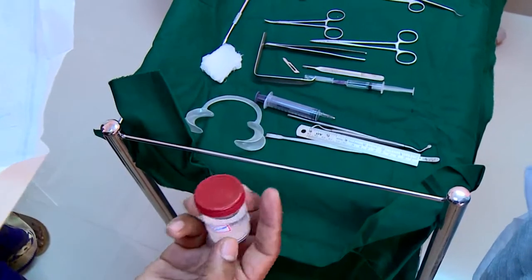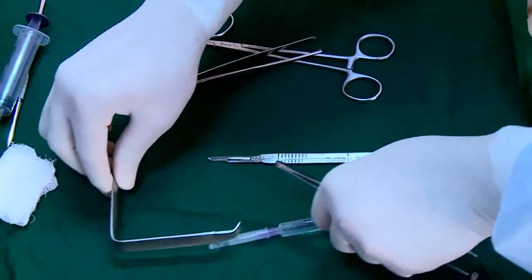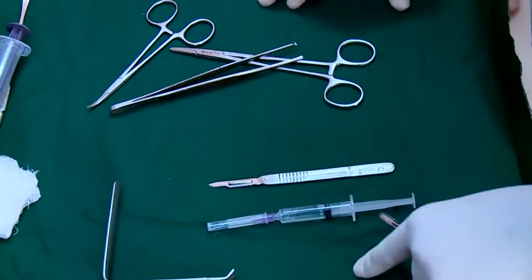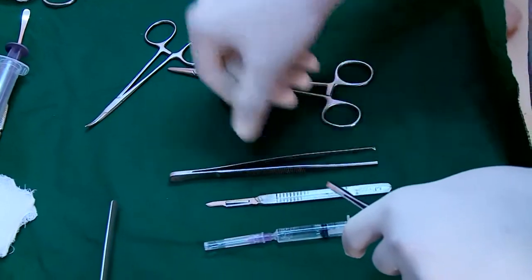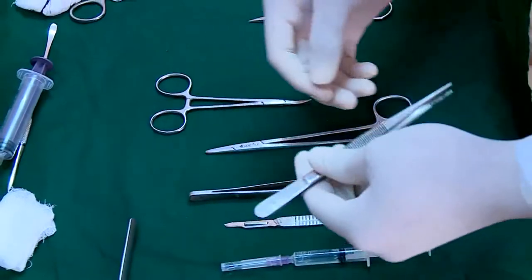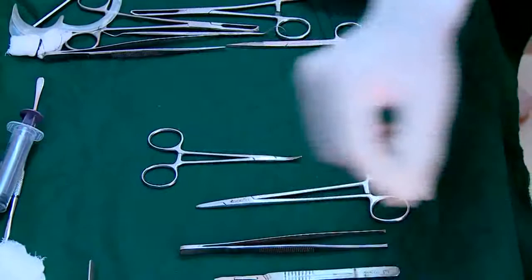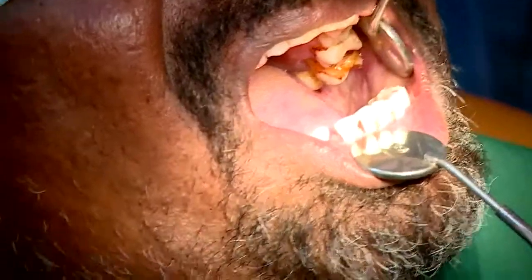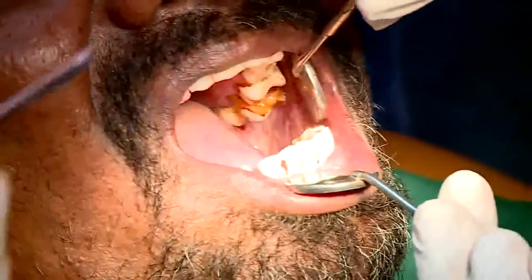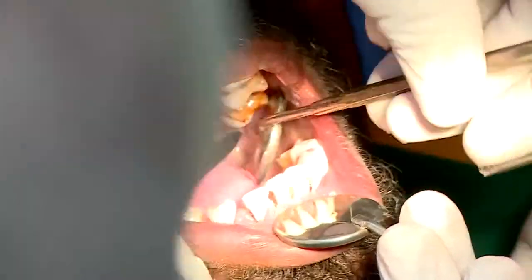So don't try squeezing your specimen where you have red and white areas. Try to sample the lesion as much as possible. Try to obtain the biopsy from a red area or white area if the lesion is large. If the lesion is small, focus on your red area with a substantial amount of biopsy of that area. You need to keep the anatomy of the particular area in mind, because of the opening of the parotid duct also. So, do you see that, or do you have to avoid that?